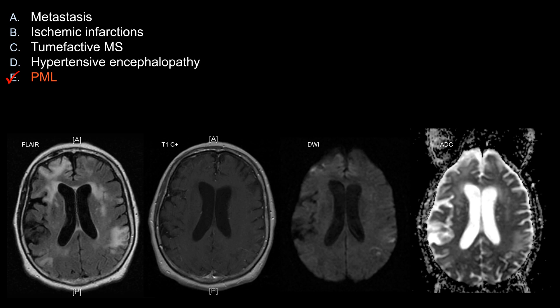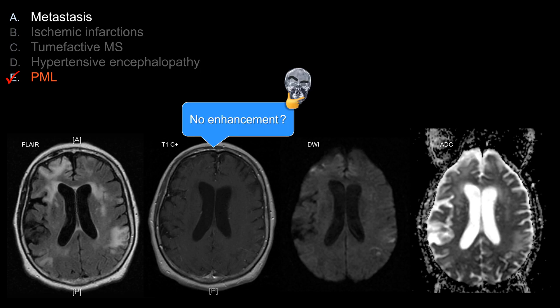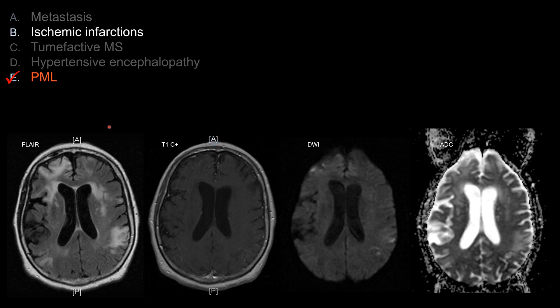Let's look at some other answers that do not work as well in this case. For metastasis, it would be very strange to have a metastasis without enhancement. For choice B, ischemic infarction, there is no evidence of restricted diffusion. There is a bright signal in DWI but no dark signal on ADC.